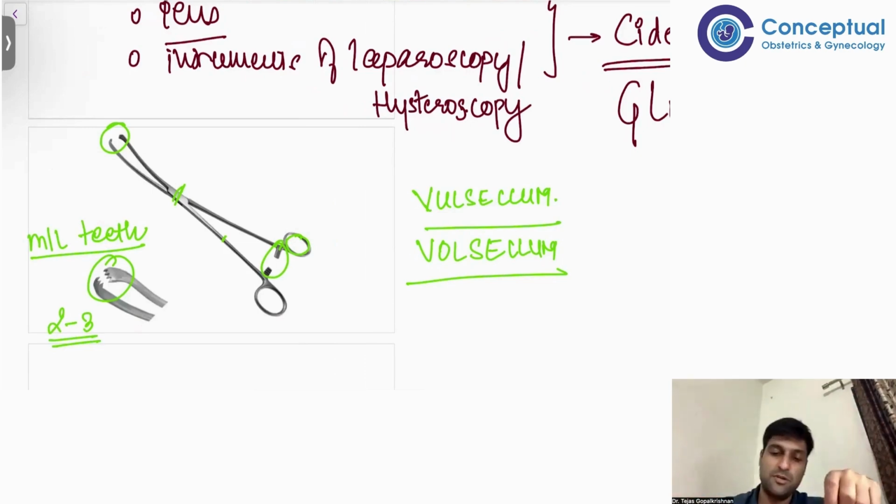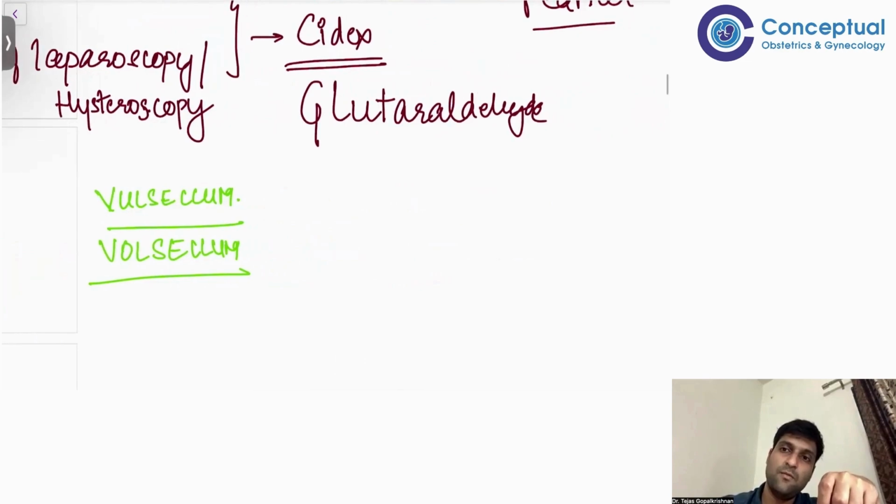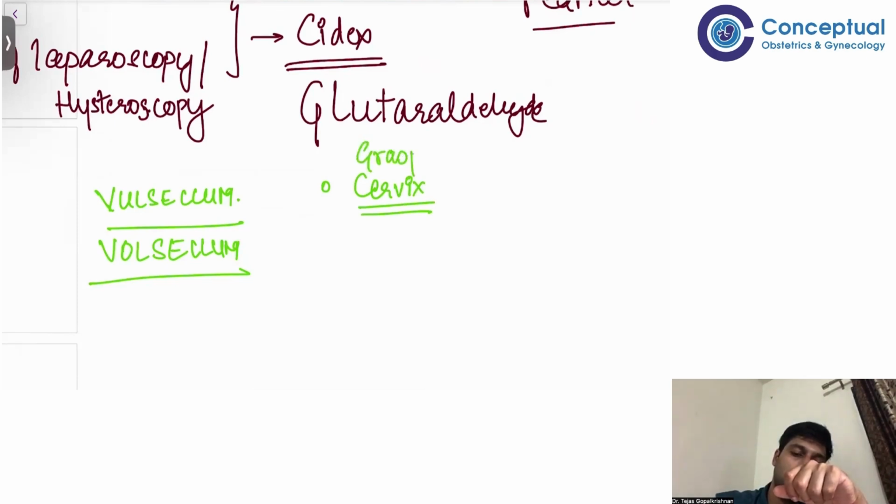What is it being used to grasp? For what are we using it? Tell me. Correct, cervix. We are using it to grasp the cervix. It is used to grasp the cervix.